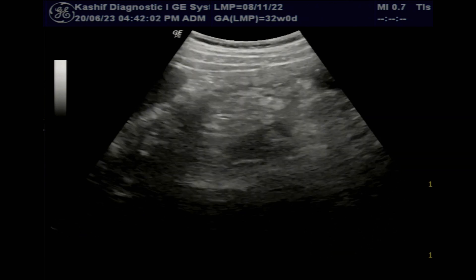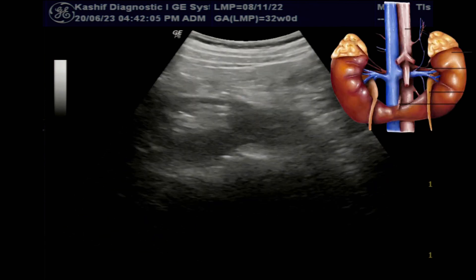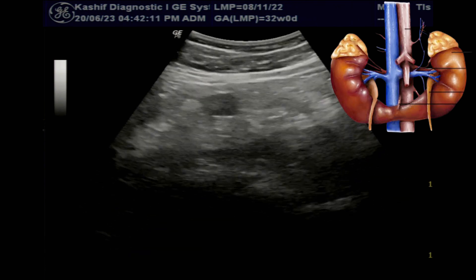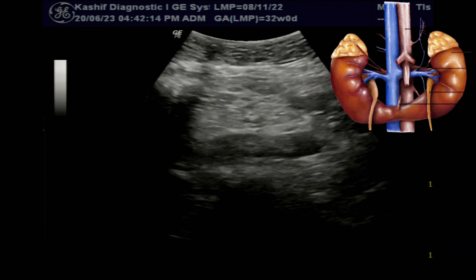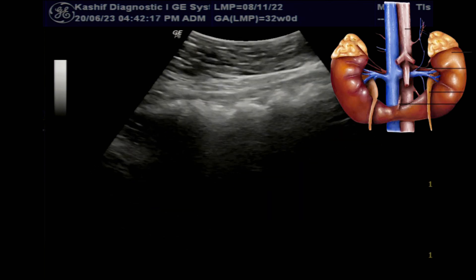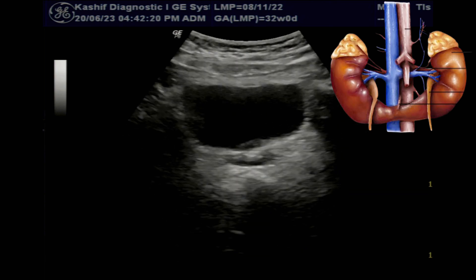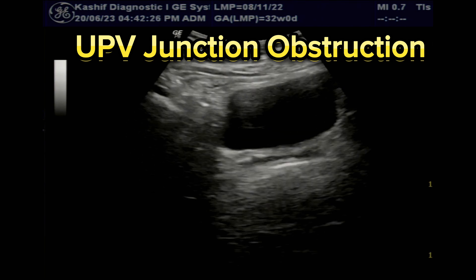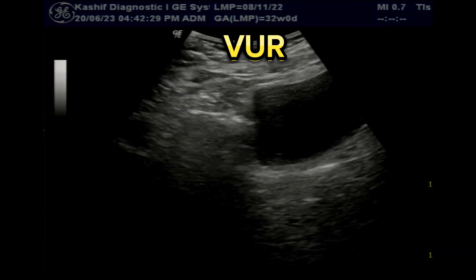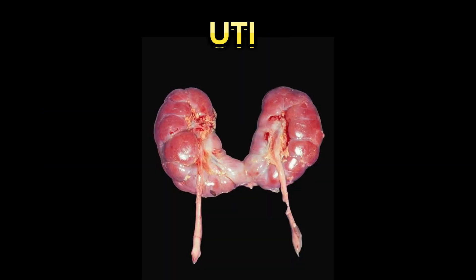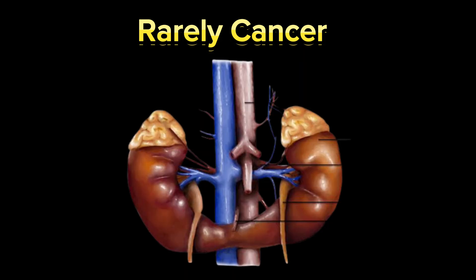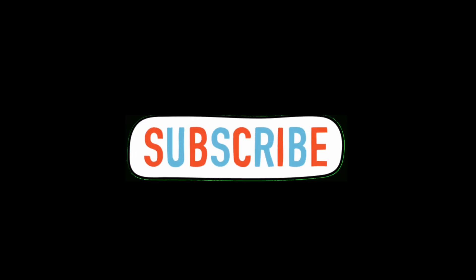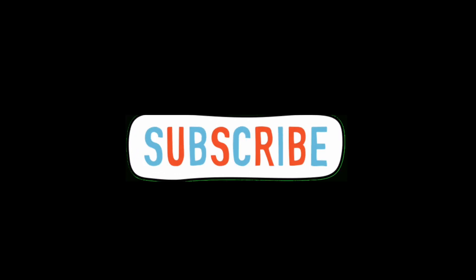Horseshoe kidneys usually don't cause any serious health problems, and people can live a full active life. However, due to fusion and malrotation, the ureter needs to pass over the isthmus or down the anterior surface of the kidneys, which causes urinary drainage problems and stasis. Complications include ureteropelvic junction obstruction, renal stones, vesico-ureteric reflux, urinary tract infections, or rarely transitional cell cancer.